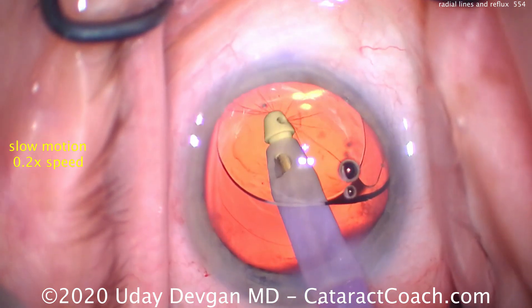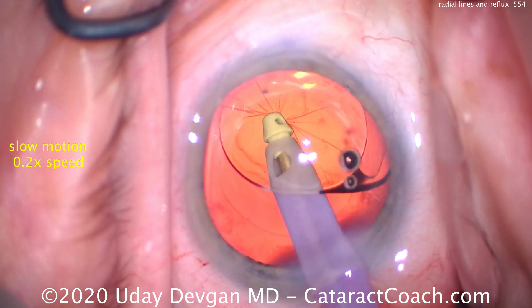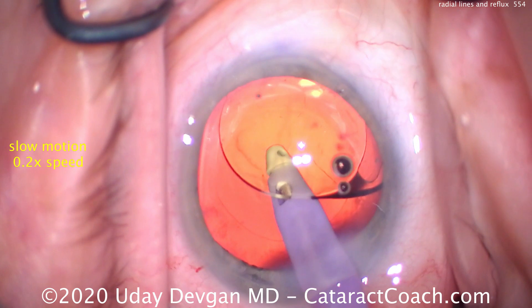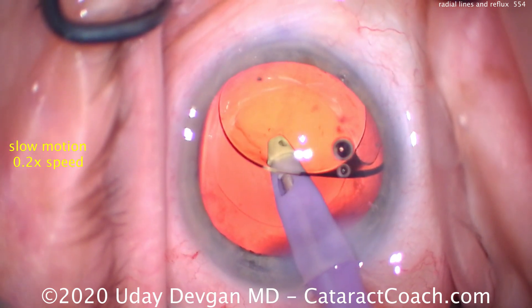So we use reflux mode and it releases the capsule from the suction port — it goes back. Now we stop reflux and we can go back to normal vacuum aspiration to continue removing all the viscoelastic.